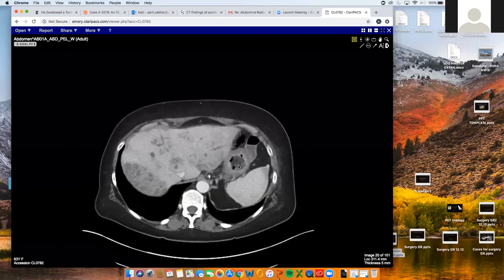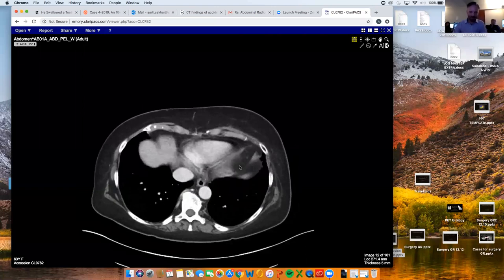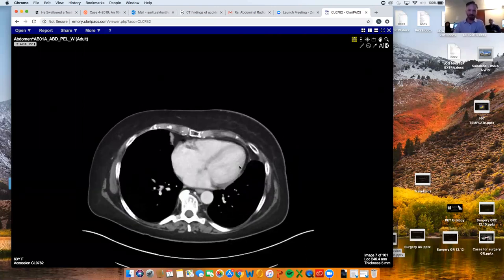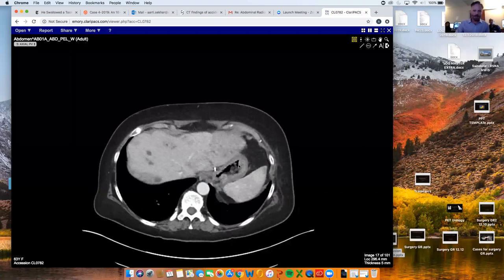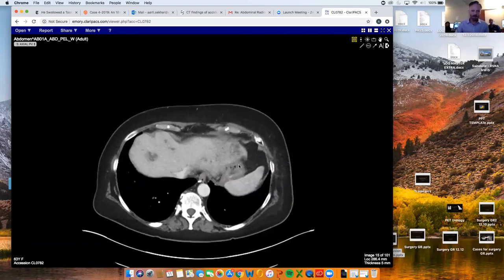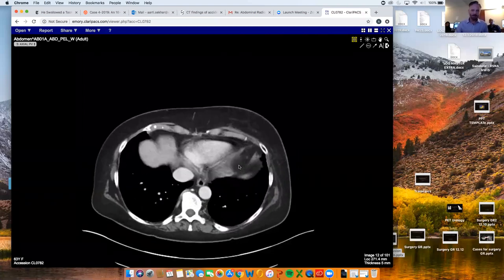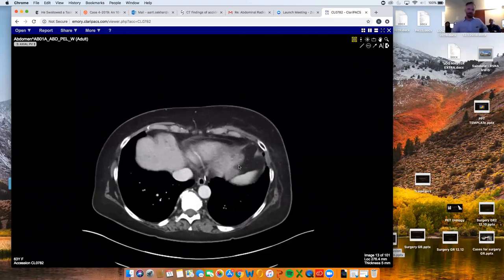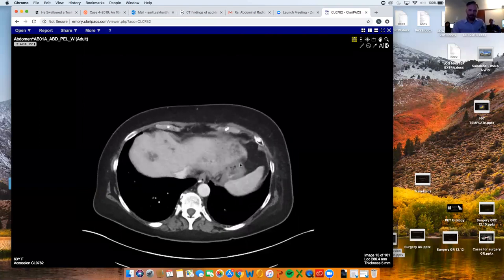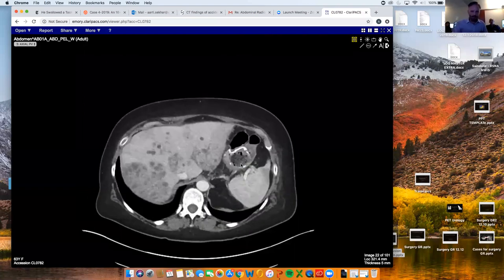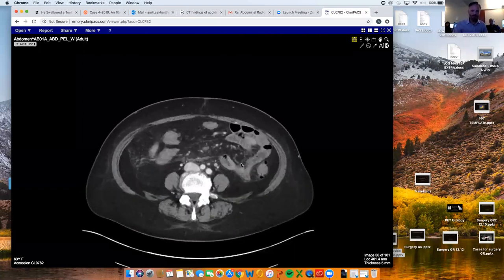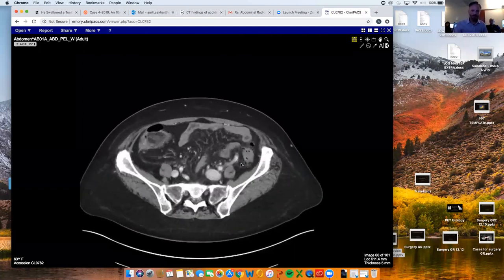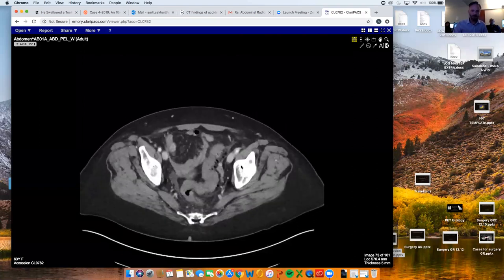So this patient apparently just had several weeks of general malaise and a little weight loss, apparently a little bit of fever. She went into her primary doc and he got a CAT scan. So just a quick scroll through here and then we'll go back.